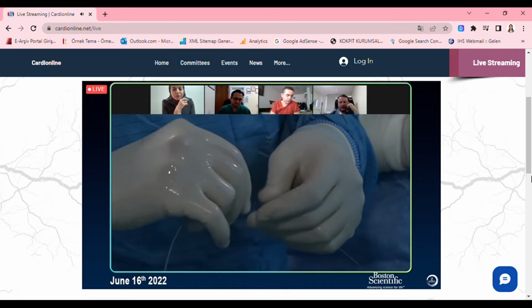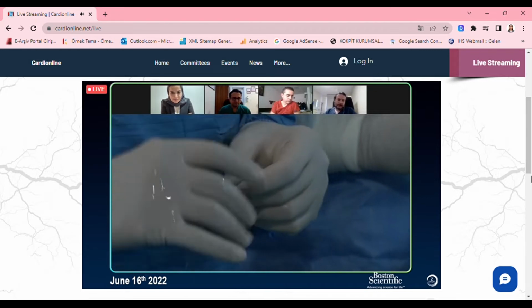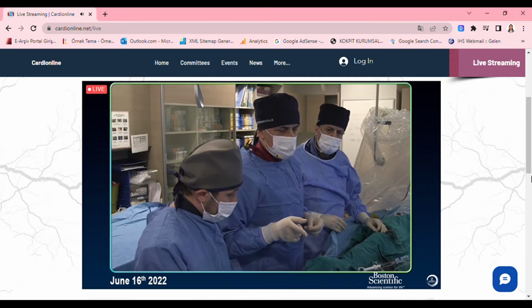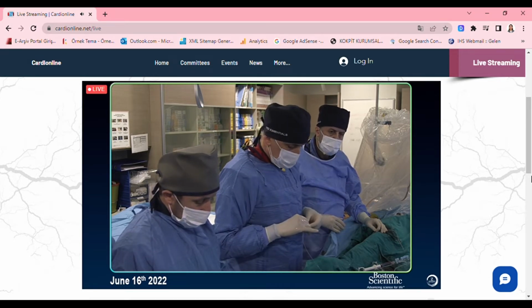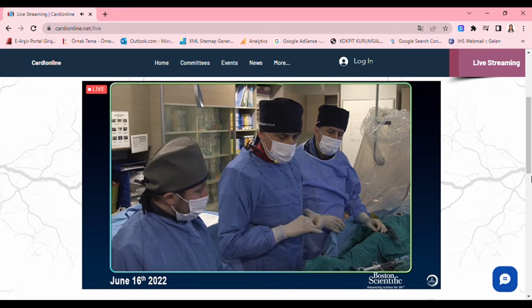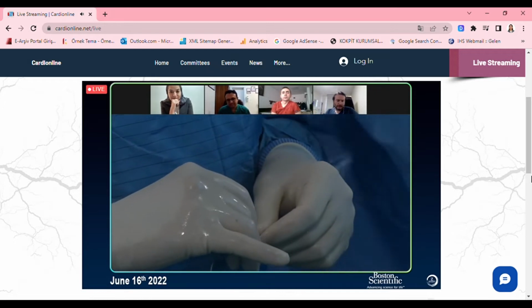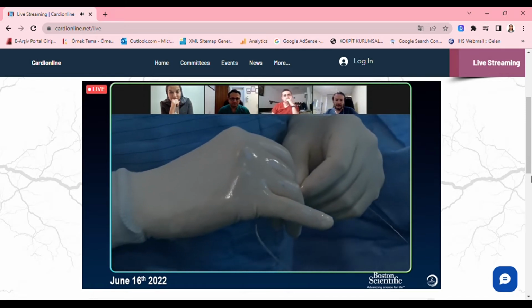And what size burr are you using? Yes, that's important. What do you suggest, first of all? What is the vessel size on the IVUS? What's the distal vessel size? Yeah, the distal is 3. When you go to the proximal, 3.5 to 4.0. 1.75. 1.75, okay, because probably your calcium is mainly proximal. So maybe a 1.75. Right, I choose the same 1.75. Yeah, because we can start with a smaller one, but the cost will be doubled. So we choose 1.75 directly for the one.